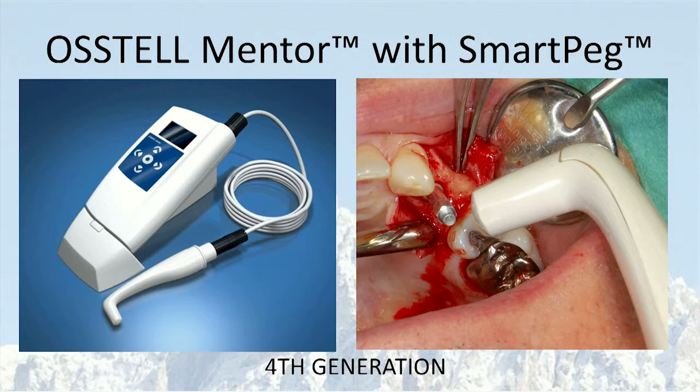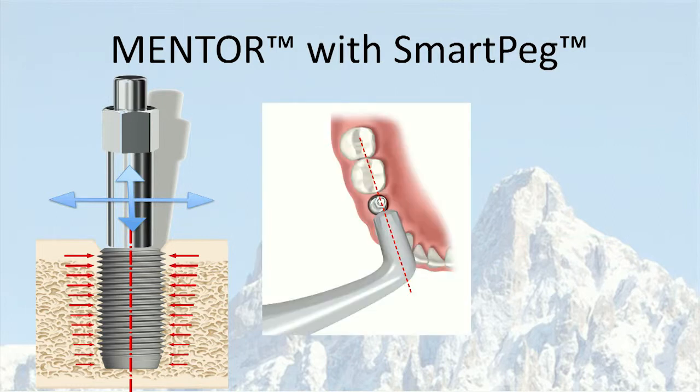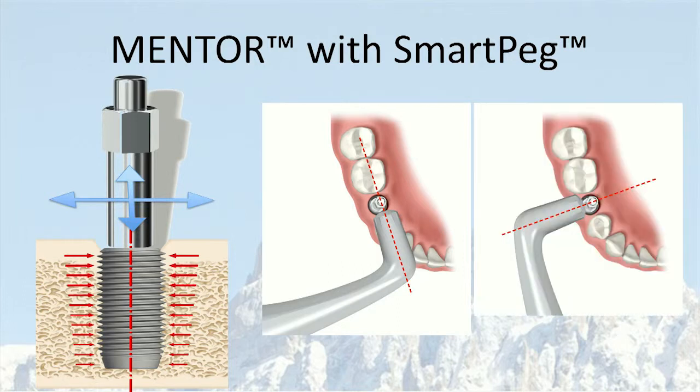And this transducer is actually vibrating in at least 2 different directions. So it means that it can measure the lowest and the highest ISQ in different directions. With the first instrument, we had to do 2 measurements in order to pick up the 2 different stabilities in different directions. So there was a need again then to develop this technique.